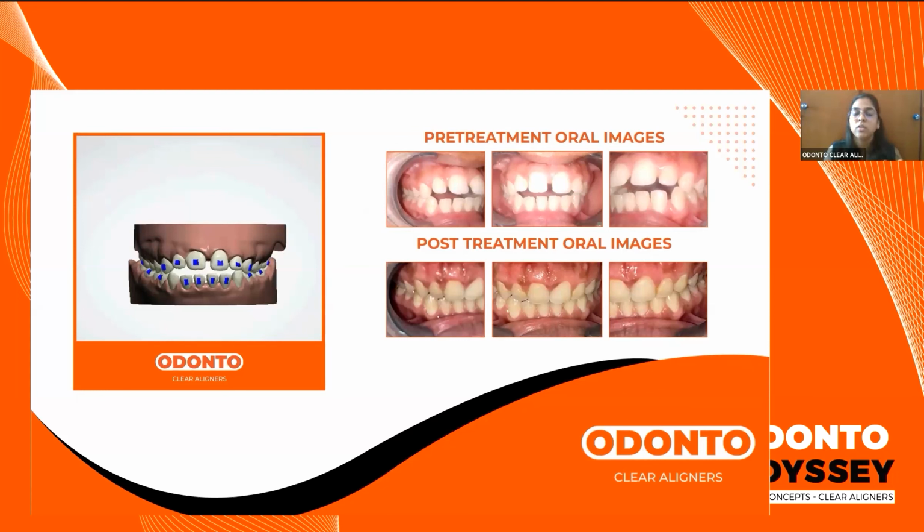It also helps you to gain confidence in using aligners, and that helps you to progress to more moderate cases and even complex cases using a hybrid approach, wherein if it's extremely complex, like deep bites are there, then you can also balance them out with your conventional braces. But we try to keep it up to your moderate category, wherein we can try to treat the entire malocclusion using aligners alone. These cases will also help you in that if you have good results, then your patient referrals also increase because there's greater chance of patient satisfaction.